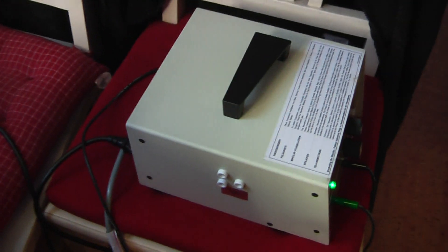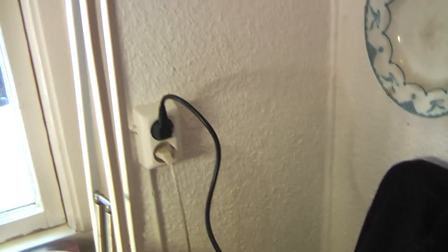You have this one — you have electricity. You need to put something underneath the animal, this pad. It's very important, otherwise it doesn't work.